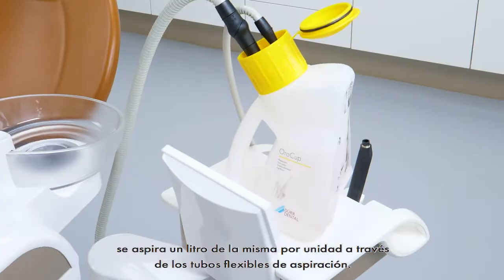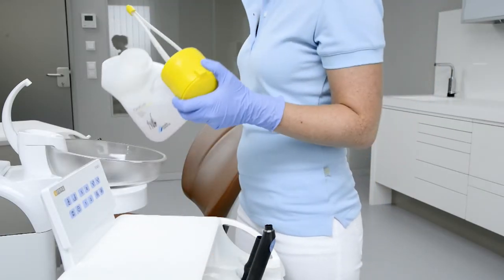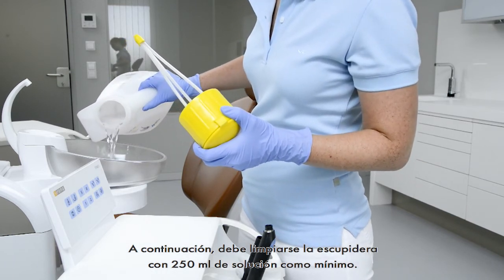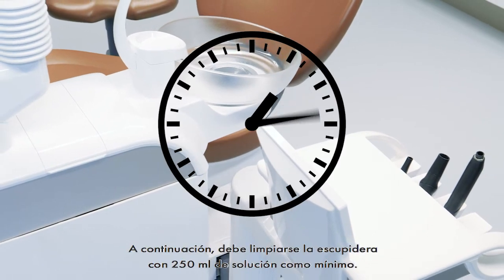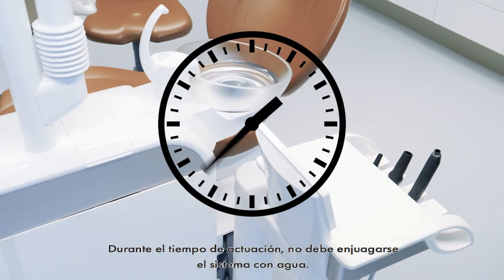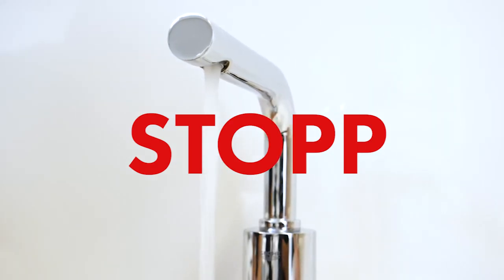After the preparation of the solution, one litre of the ready-to-use solution per unit is aspirated via the suction hoses. The spittoon must then be cleaned with at least 250 millilitres of solution. It is essential to adhere to the exposure times defined by the manufacturer in order to successfully clean the suction system. The system must not be rinsed with water during the exposure time.